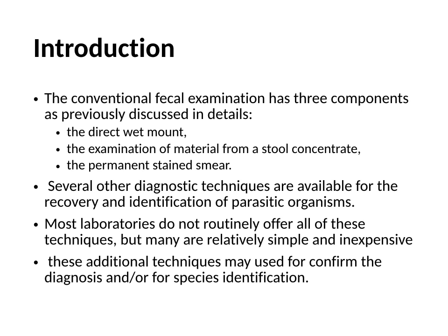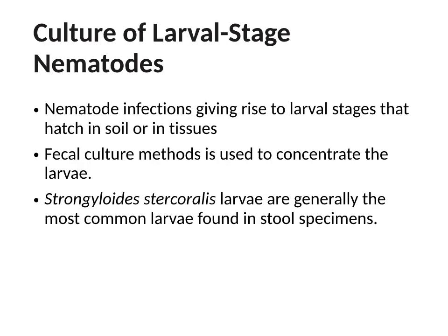Culture of larval stage nematodes. This method is used to concentrate the larvae in a stool specimen. For example, Strongyloides stercoralis larvae may be recovered by this method.